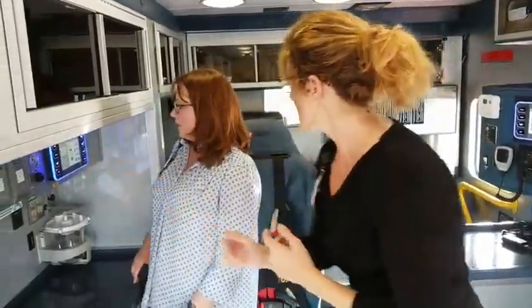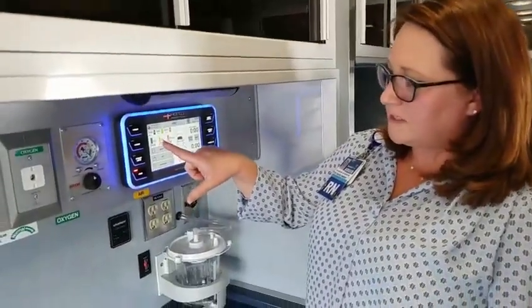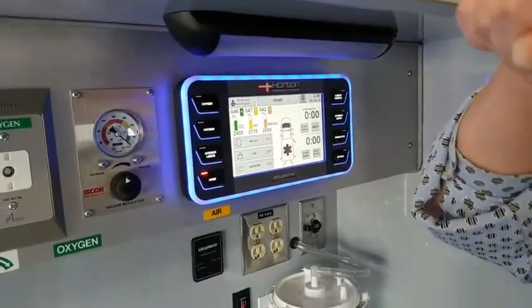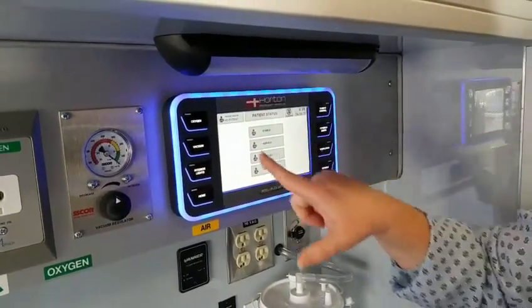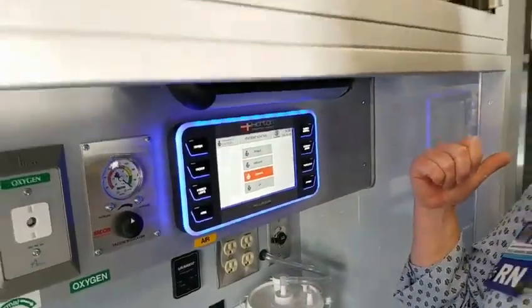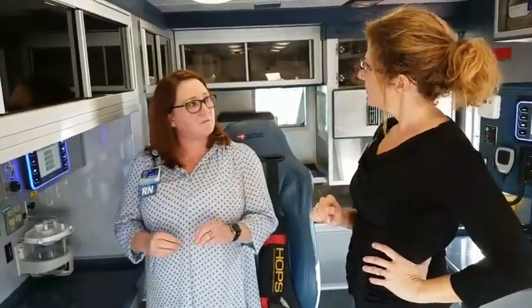Tell me about this little computer screen here and what that does for us. Okay, sure. So here on the computer screen you can see O2, air, and Heliox. That allows us to monitor the level of the tanks that Jesse showed you on the outside of the ambulance. Another feature is that if we have a change in our patient condition and we're in the back, we can go to this screen and push this button. That will alarm up front, letting Jesse know that we've had a change in the patient condition. And it's really important to do that without yelling up to him because we may have a parent riding with us and we don't want to upset the parent. Exactly, but you want to get that message across to Jesse as efficiently as possible. Yes.